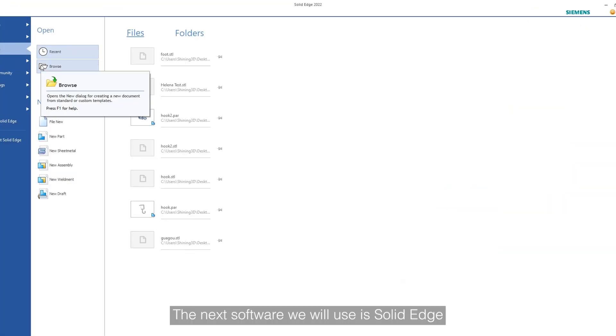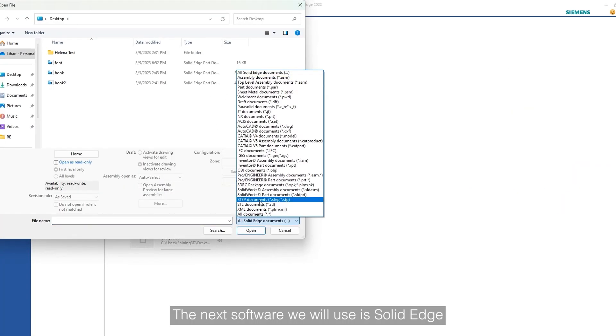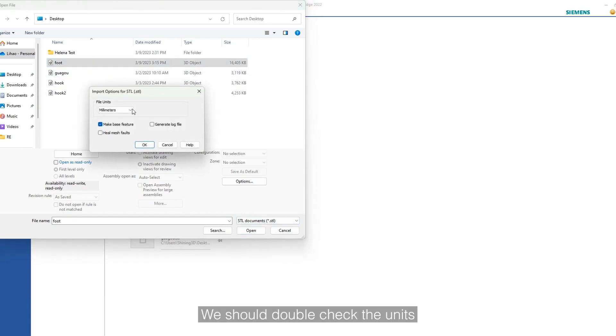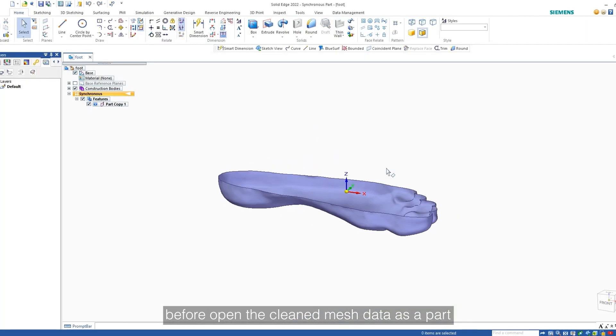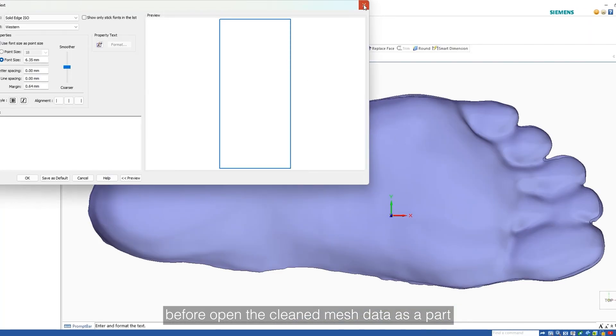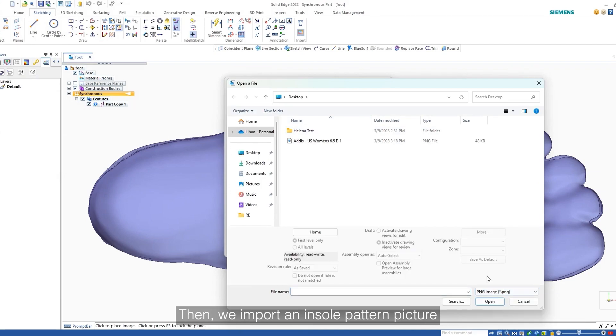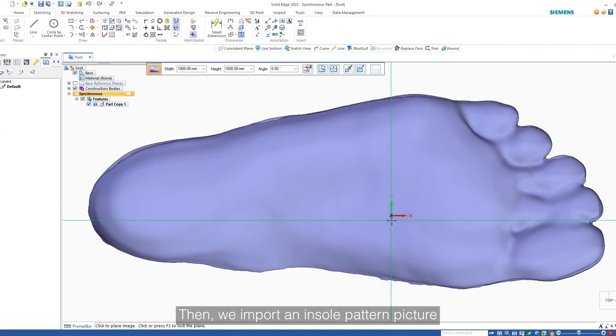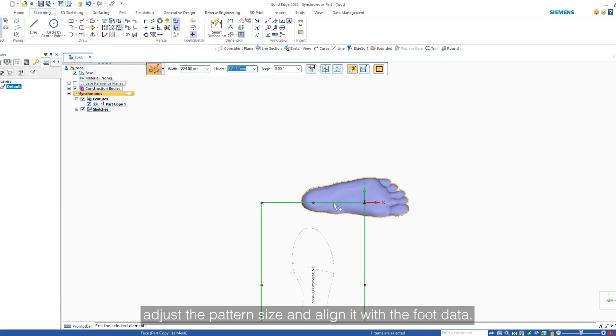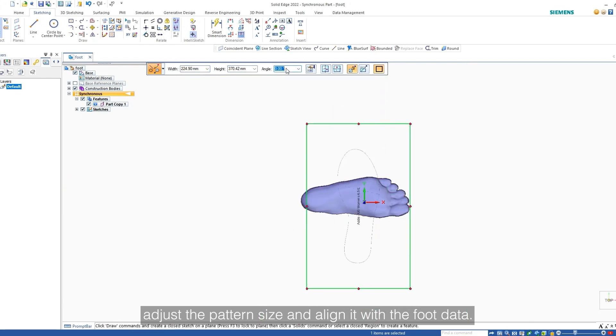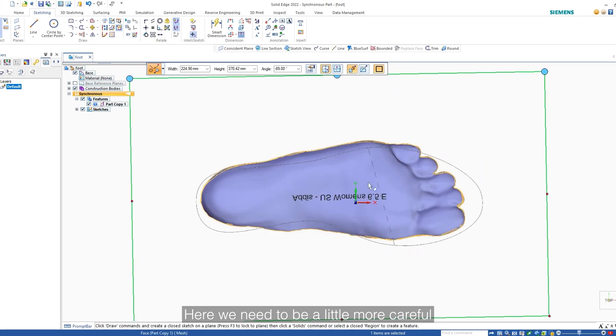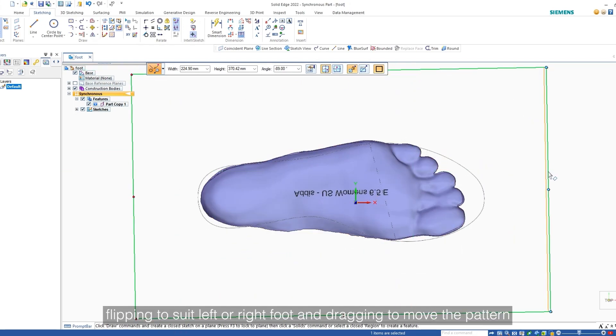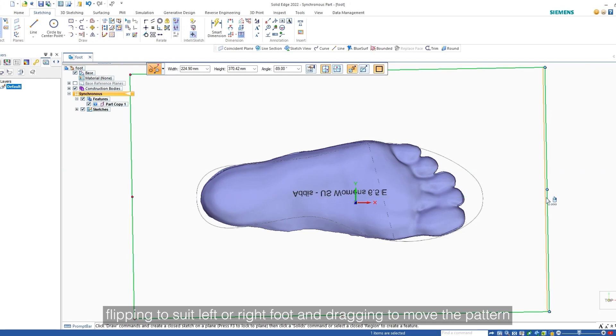The next software we will use is Solid Edge. We should double check the units before opening the cleaned mesh data as a part. Then, we import an insole pattern picture, adjust the pattern size, and align it with the foot data. Here, we need to be a little more careful, flipping to suit left or right foot, and dragging to move the pattern.